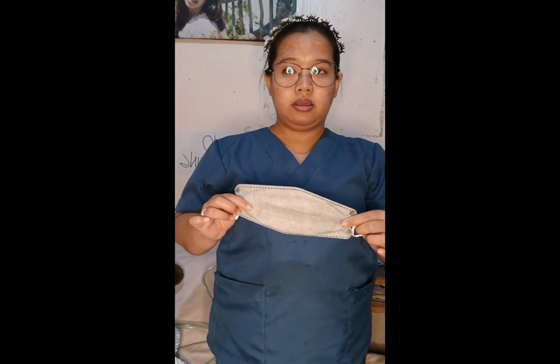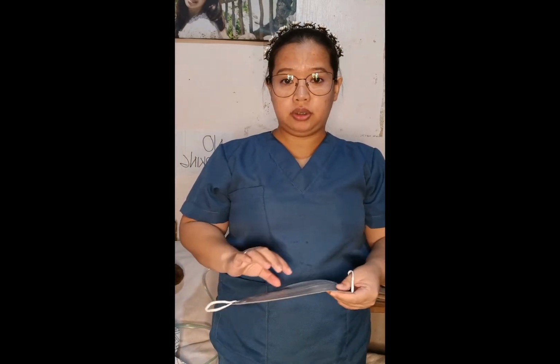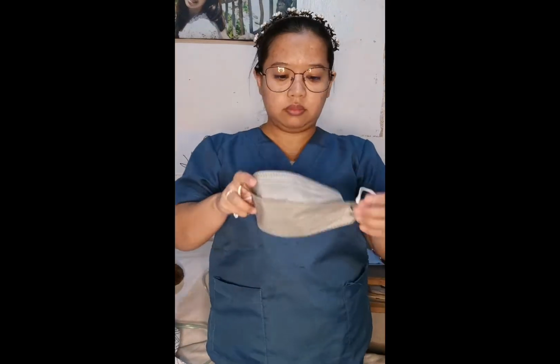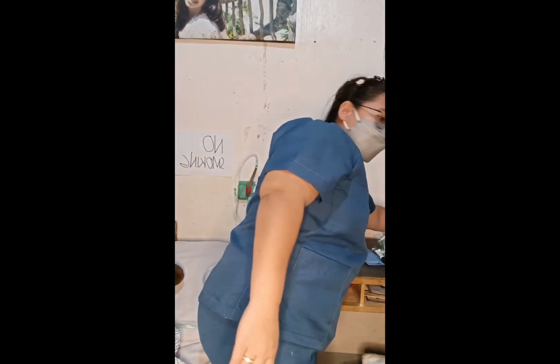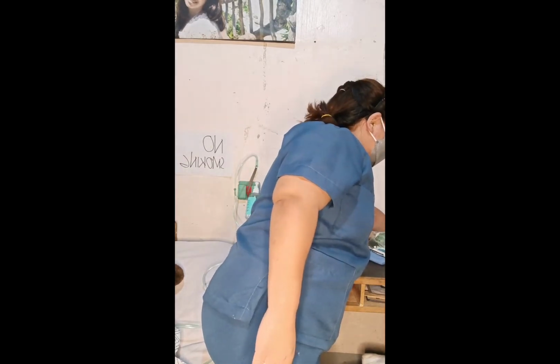First, before we start administering the oxygen, we need to make sure that we wash our hands, mask, and we wear our surgical gloves. This is to prevent germs from spreading. Now we will be wearing our surgical mask.